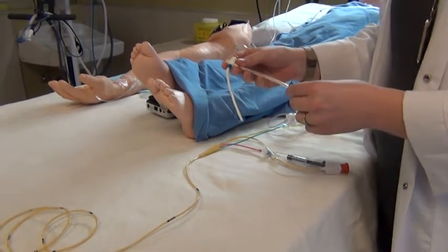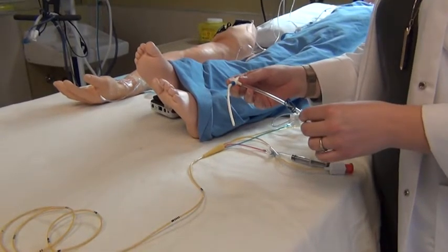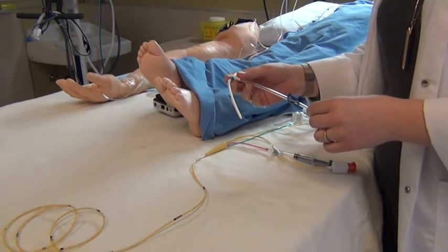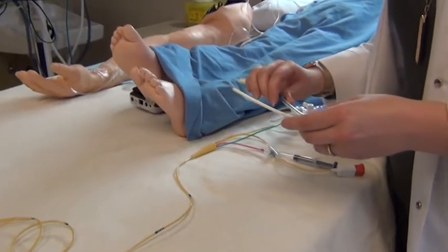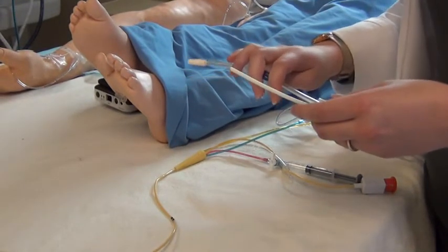Here we're going to demonstrate a pulmonary artery catheter. This is a device that's often used in critical care settings to gather values regarding cardiac output, systemic vascular resistance, and pulmonary artery pressures. It also allows us to get mixed venous blood gas samples to assess oxygenation, perfusion, and essentially tissue use of oxygen.